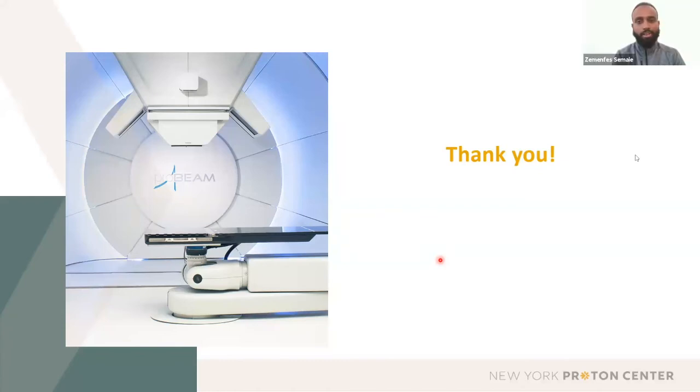Yeah, it's very similar for us. The guidelines that you're going to use to come up with the minimum time required to hold your breath all depends on treatment time, how long your CBCT is going to take. Our CBCT takes a little bit longer. The patients are able to breathe out during the CBCT. You can pause the CBCT and pick it back up the second time. However, if there's many pauses as you're doing the CBCT, then when it does the reconstruction, your image quality is going to decrease. So it's really recommended 20 seconds or higher during that. And this is evaluated by the primary physician during consultation, so we're able to get good candidates that will benefit from the SDX treatments.